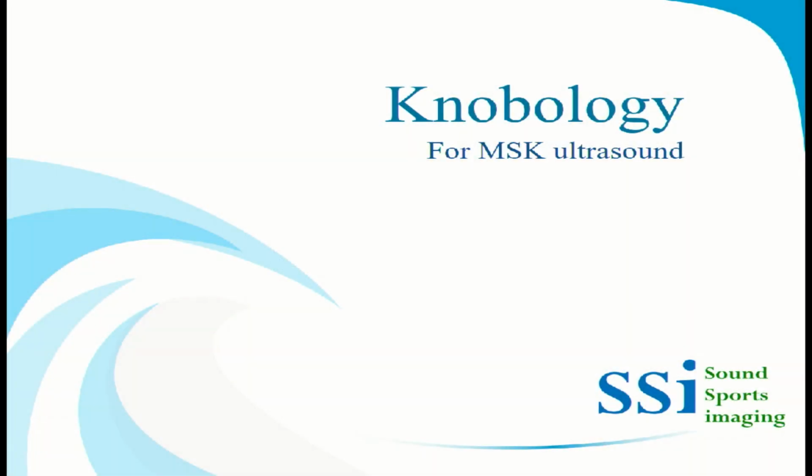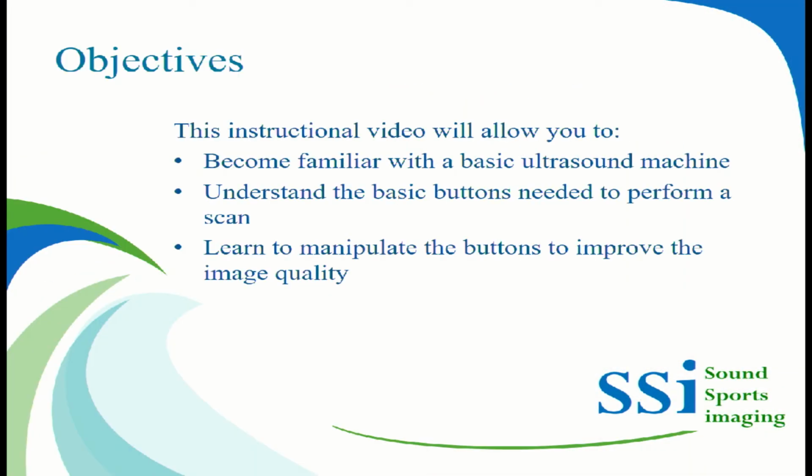Knobology for MSK ultrasound. This instructional video will allow you to become familiar with the basic ultrasound machine, understand the basic buttons needed to perform a scan, and learn to manipulate the buttons to improve the image quality.